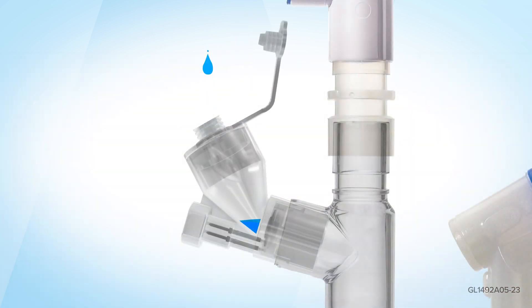Open the plug on the Aerogen Solo, insert medication, then close the plug.